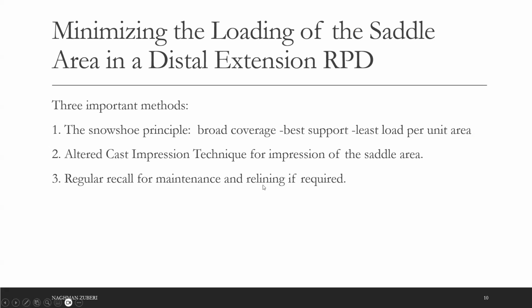I can make another lecture for you guys if you want, on how we check the need for relining in the distal extension denture, what the methods for that are, and how we do the relining. If there was any question on that, you can always let me know. So relining, if it is required, is done.